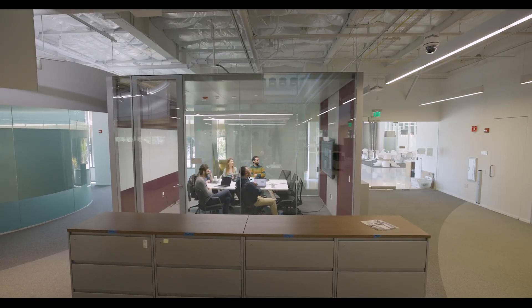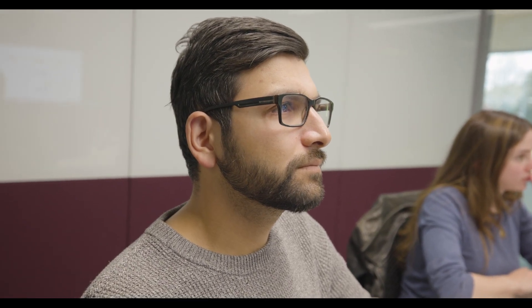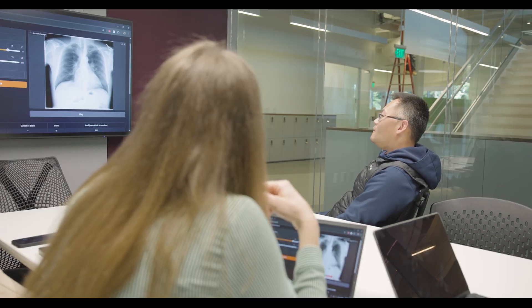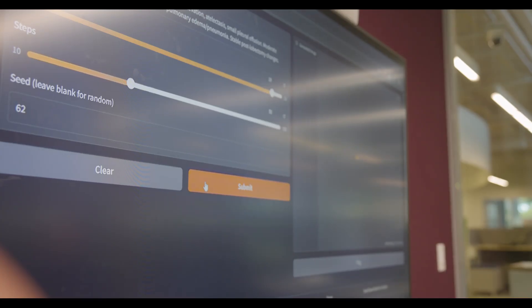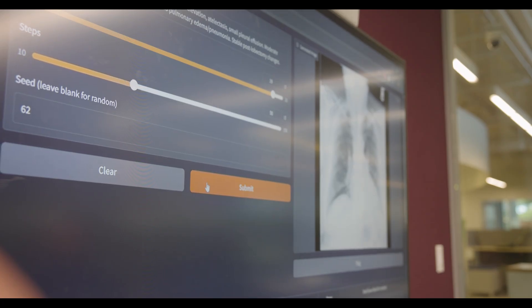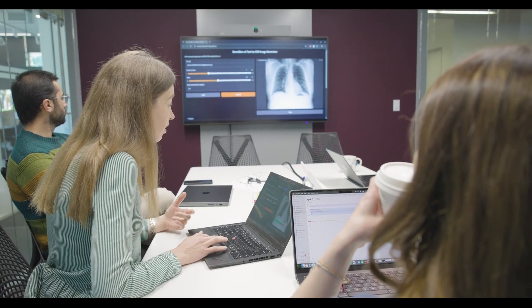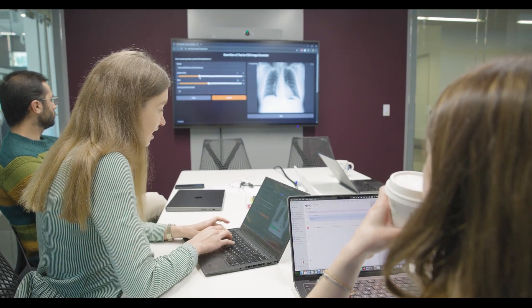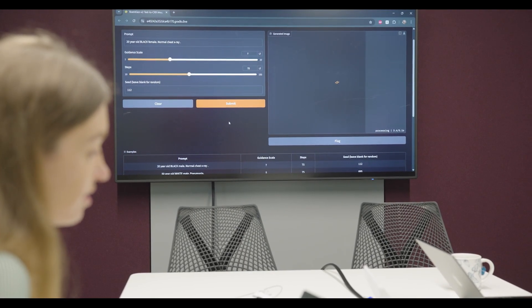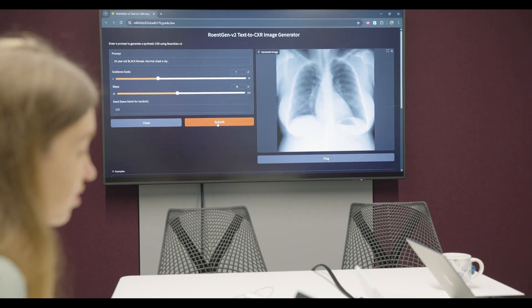One thing I wanted to share about RENTGEN V2 is this interactive inference demo, where we can take a closer look at how the model responds to various prompts. One of the cool updates for V2 versus V1 is we introduced demographic information in the prompt, where we can condition on age, race, and sex of the patient. For example, here we show a male normal chest x-ray, and if I change it to female, we should visually see a change in the chest x-ray corresponding to a female.